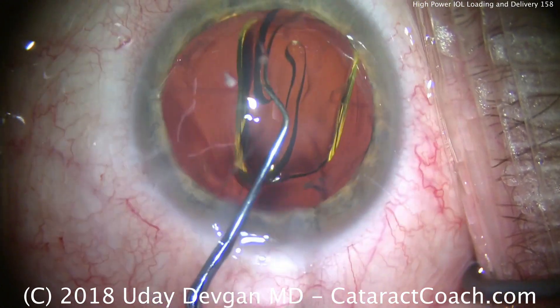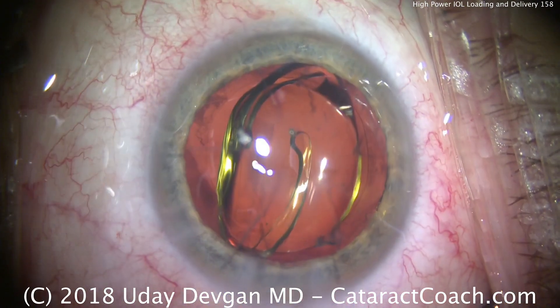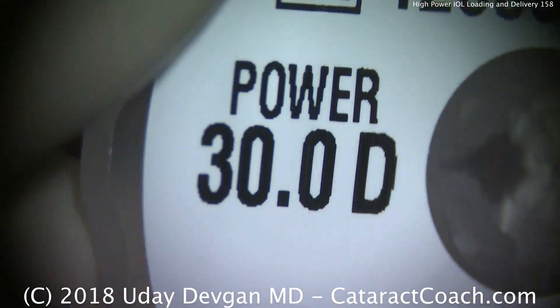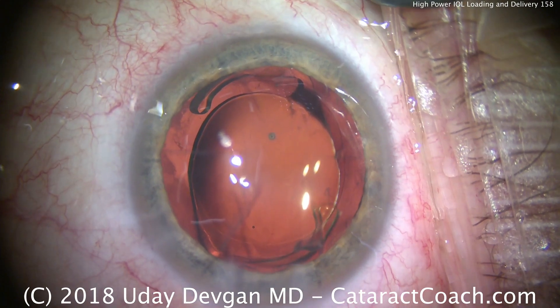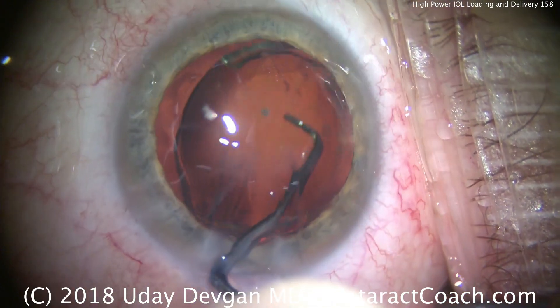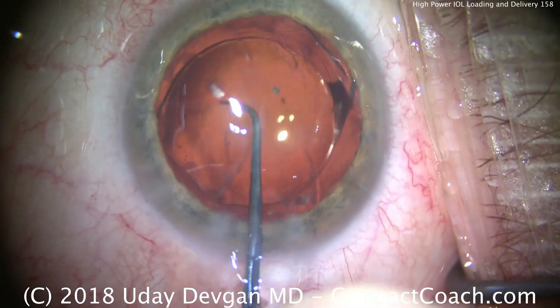There's the lens. We're going to unfold it in the capsular bag and make sure the haptics open up completely. These lenses are very thick — there's the 30 diopter power. This patient had prior radial keratotomy which was very aggressive and resulted in a lot of post-operative hyperopia. As a result, this 30 diopter lens power is really required.